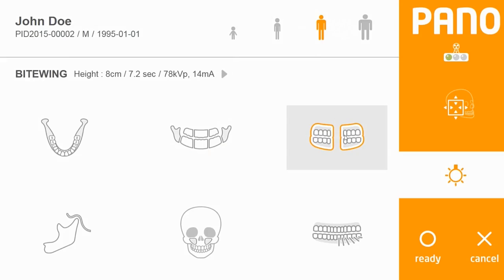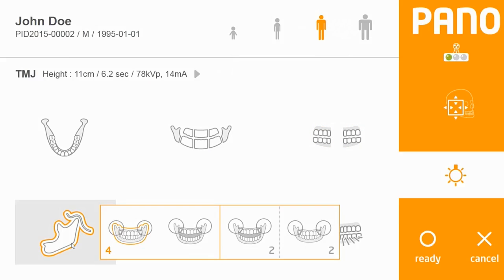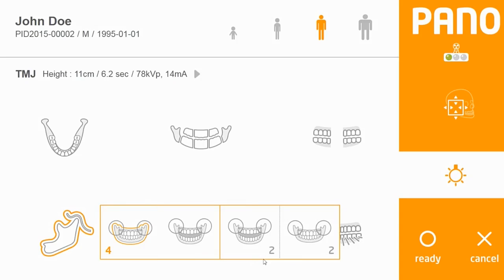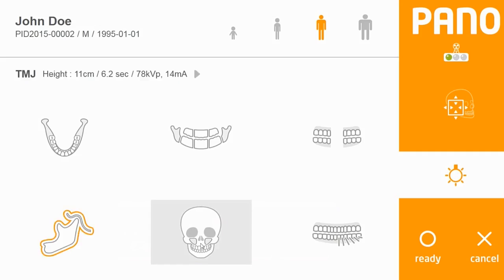To the right is the external bite wing option. Below the standard panoramic option is a two-dimensional TMJ acquisition. This lets you take one or two rotations around the patient. Choosing two rotations will scan the patient's right joints open and close next to each other, and their left joints as well.